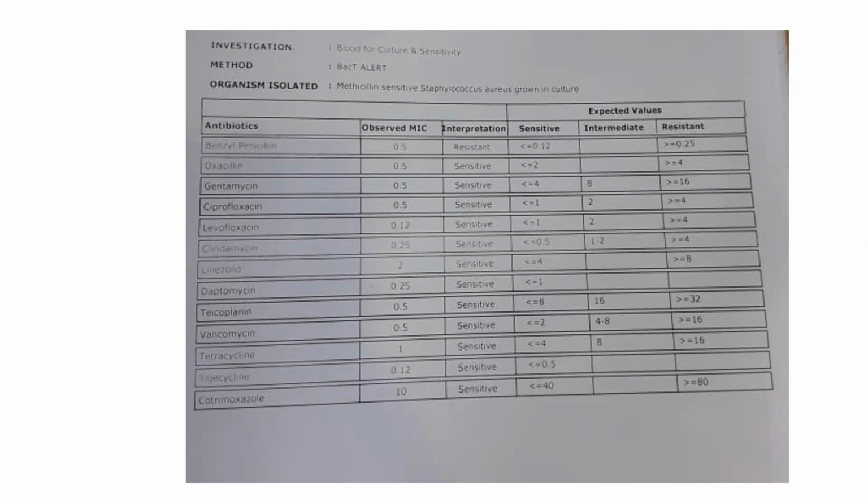So Bacti alert, you explained very well. Based upon what you have told us so far, what I'm assuming is for urine culture, there won't be a Bacti alert, right? Because we will not put it in that bottle. Is that correct? Correct. That's right. Okay. So urine will go into a direct solid growth medium like an agar.